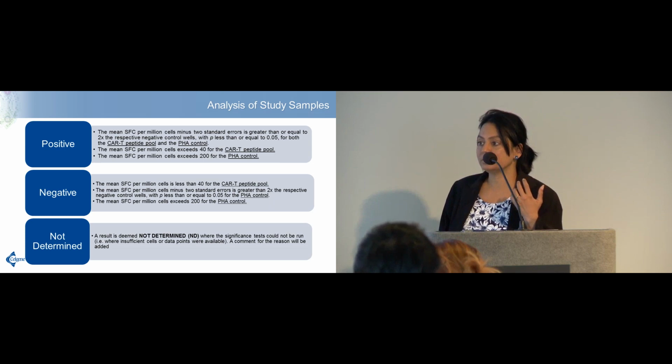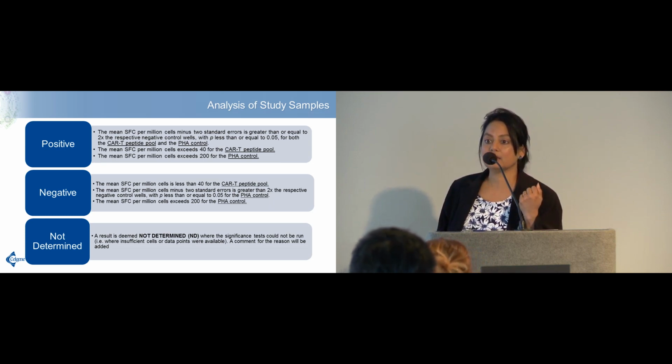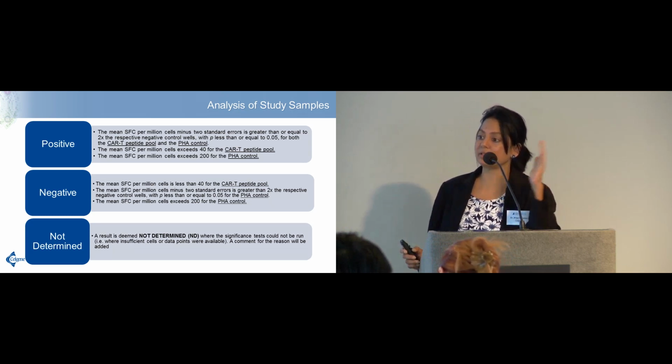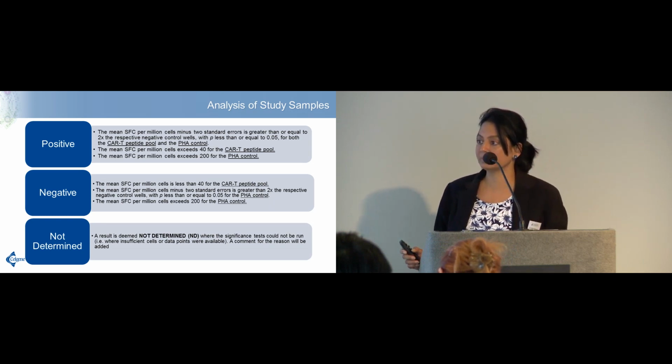Is there correlation with PK? Is there correlation with efficacy? And see if we can maybe minimize the number of samples that we have to collect. If we're collecting over 4 months, and maybe it's always month 2 that's the highest, then we can reduce it to just 1 sample per patient.